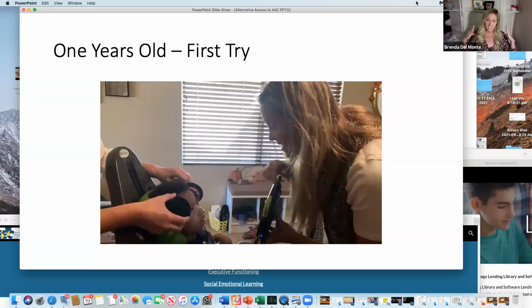But the reason I think that is because if movement is super hard already, with 1 switch we're setting it to automatic scan. The device is listing off things every 3 to 5 seconds, because research through Linda Burkhart showed that with things longer than 5 or 6 seconds, they give up and just want to make it stop. So they make selections because they think it's broken or not working anymore. So that 3 to 5 second scan is about the amount of time you have to play with. A lot of our kids can't make a movement when they're first learning. They can't decide that's what I want and make their body move in that time frame. And sometimes kids can, and then they have a seizure, and then that time frame changes.